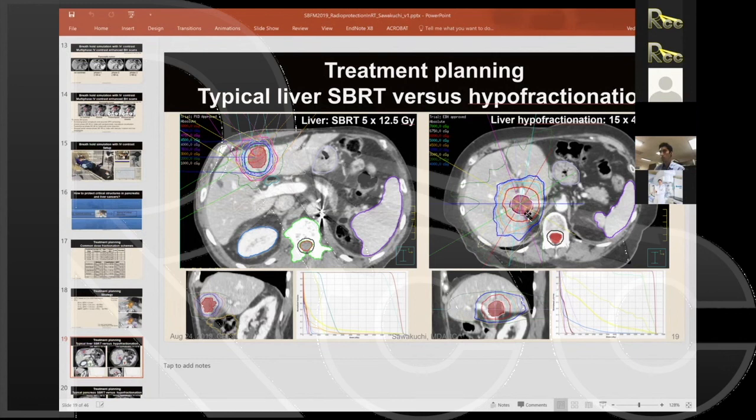Are you also present for simulation? Yes, we are. Because we have to make sure that the contrast is handled appropriately. And the therapists have been trained to do this very well, but just to ensure consistency, because the therapists rotate in and out, to make sure that everybody's on the same page.